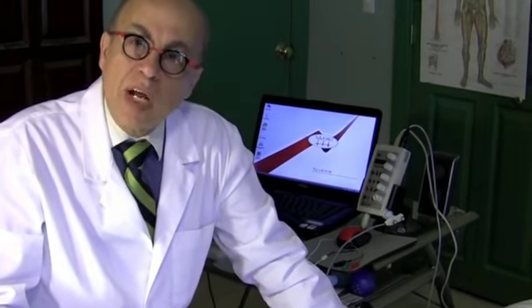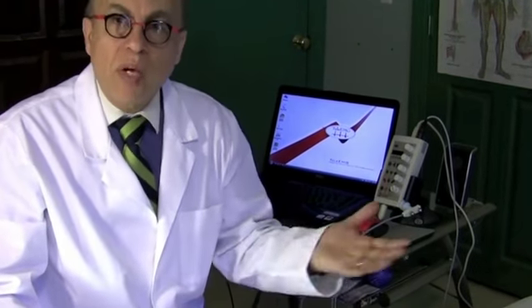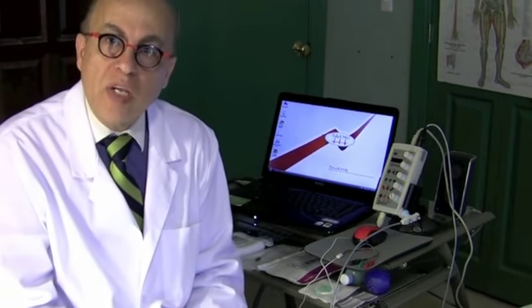Now, what are EMGs useful for? EMGs are useful for a lot of conditions and a variety of problems that affect the nervous system. The ones that you've probably heard most about is carpal tunnel. A lot of people have carpal tunnel with hand numbness and tingling and sometimes weakness, patients with low back pain, patients with diabetes who get diabetic neuropathy. For all of these conditions and others like trauma and injury and neck pain, a lot of physicians order nerve conduction studies and EMG testing because they want to see if the nerve is impaired, is damaged, how bad, and where it is impaired.